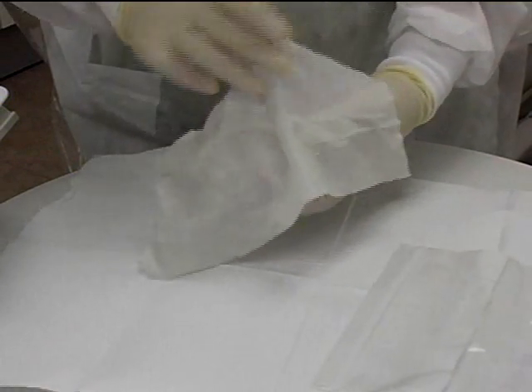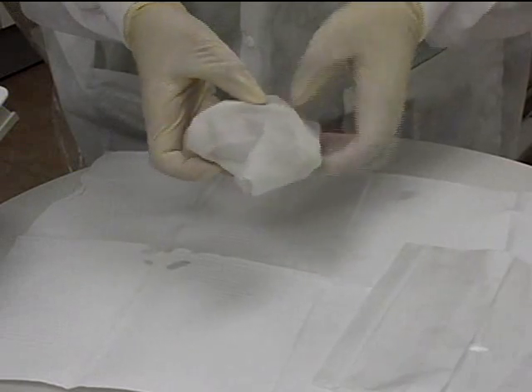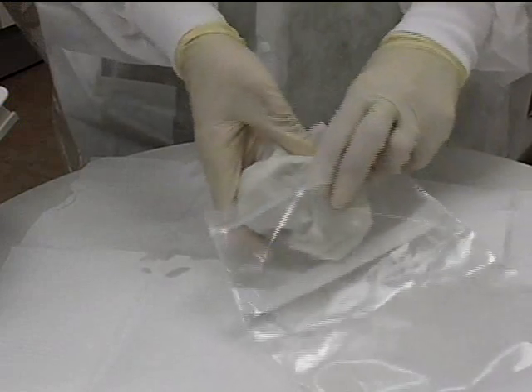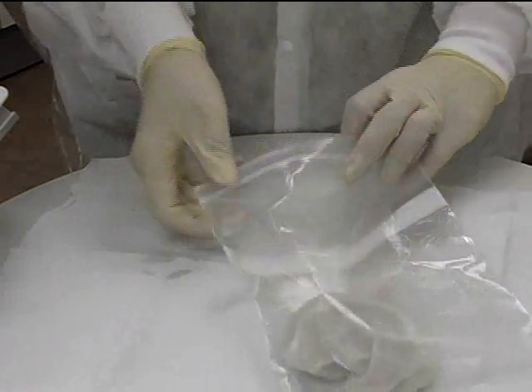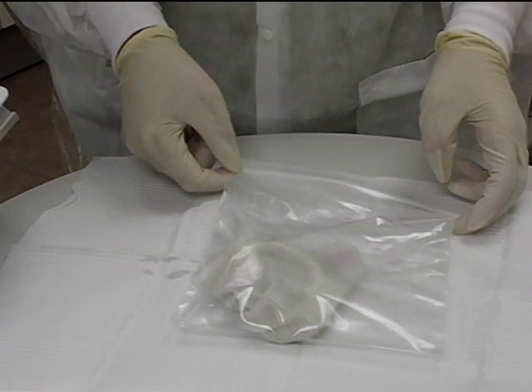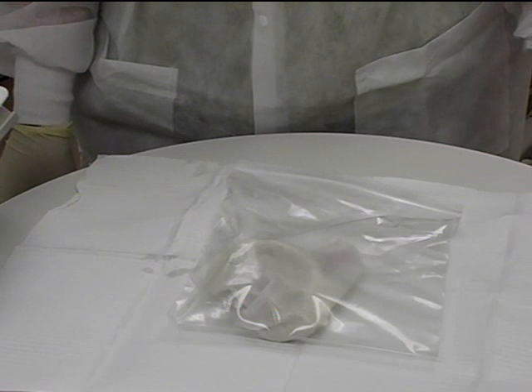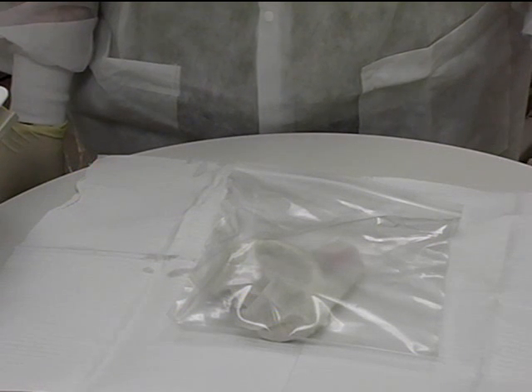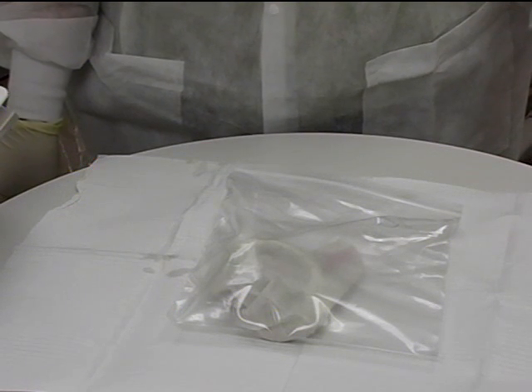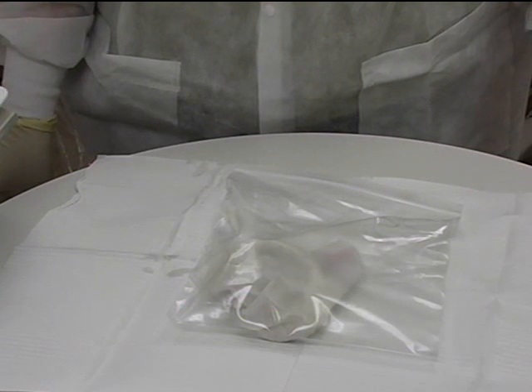Cover the impression with a damp gauze or napkin. Storing the impression in either a wet or dry environment will cause a gain or loss of water, resulting in distortion of the impression. Ideally, the impression should be poured with stone within 12 minutes after removal from the mouth. However, it also could be bagged for transportation. Some extended storage alginates are stable for up to 5 days if stored in a baggie. These impressions can be sent to a dental laboratory for fabrication of models.